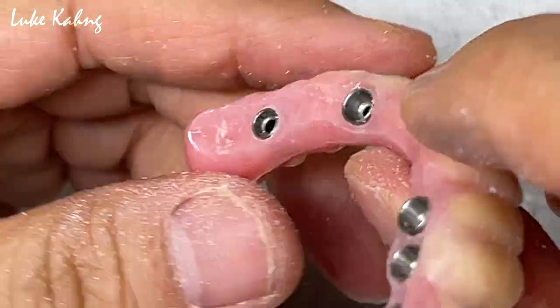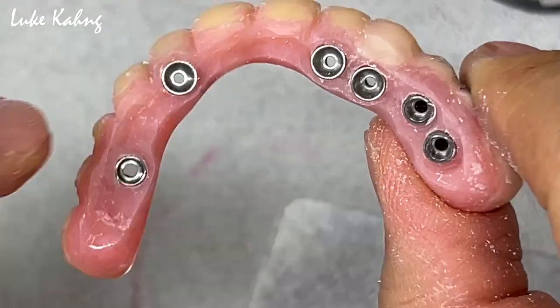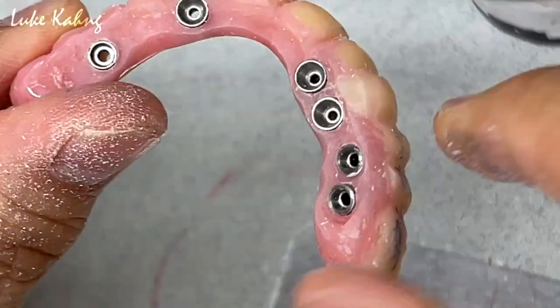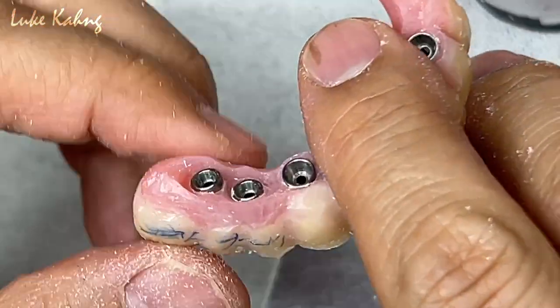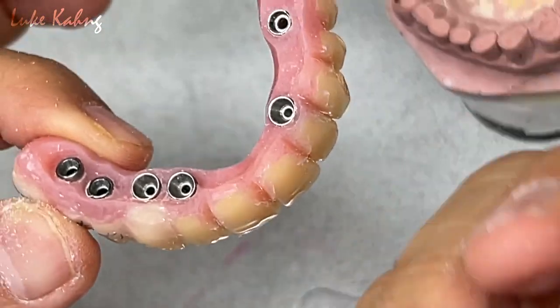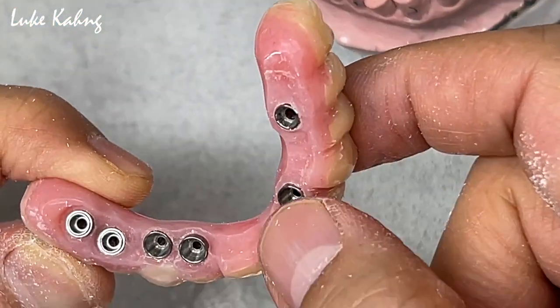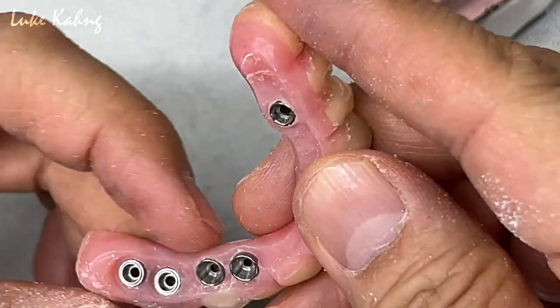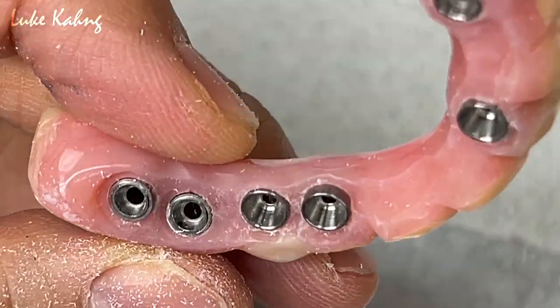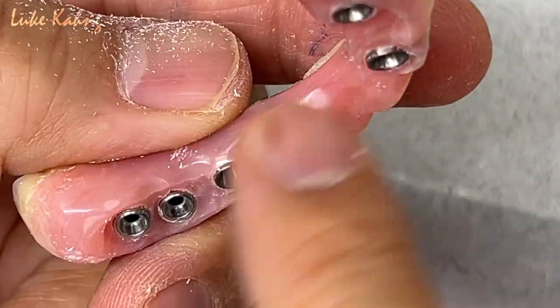Like I explained to the doctors, we're going to make a better shape and contour than this. I'm going to make a better shape, because this is PMMA — which is an immediate denture we made. So we can make it more thin. As I showed in my old video on chrome cobalt frame design, we try to make it convex or flat as much as possible. We close here, make it more thin. At this moment I don't have to grind a lot, because we're going to design it here.